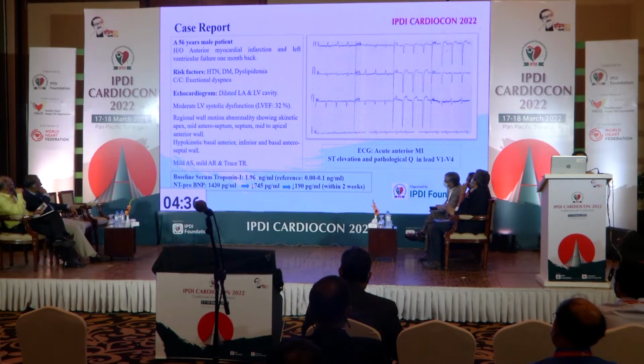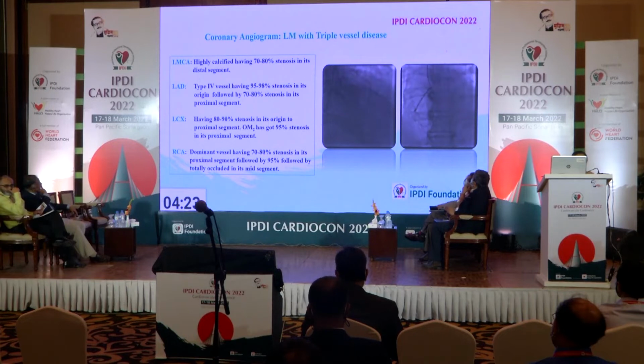And this is the ECG showing ST elevation and pathological Q wave in lead V1 to V4, indicating acute anterior MI. This is the coronary angiogram of my patient showing severe left main with triple vessel disease. Left main coronary artery disease was highly calcified and the LAD, LCX and OM have 95% stenosis, RCA showing about totally occluded in its mid segment.